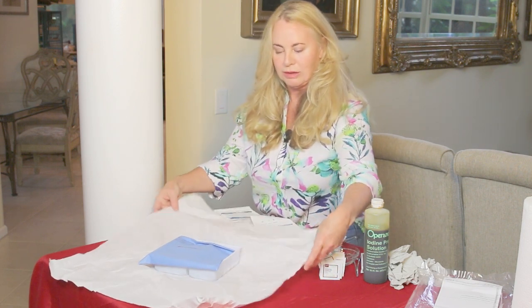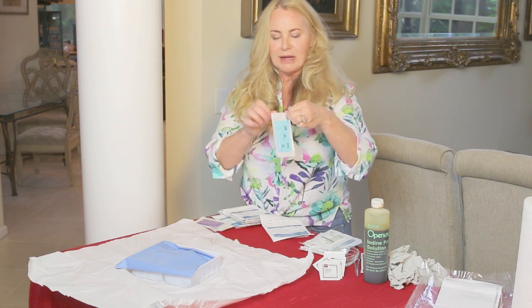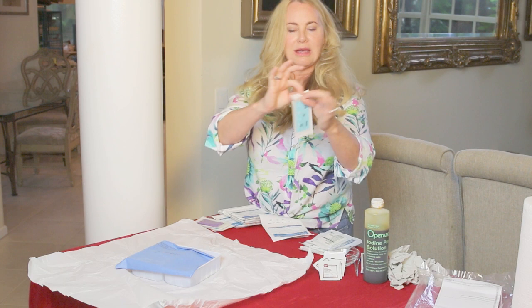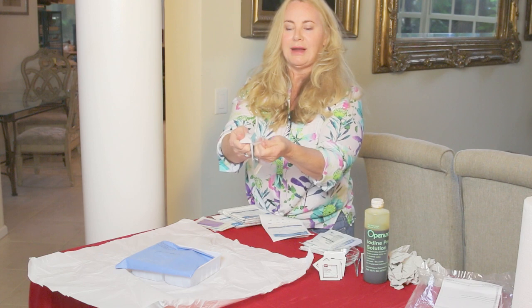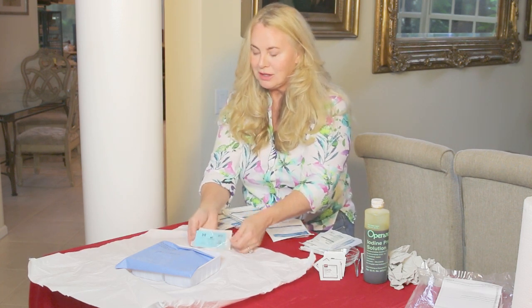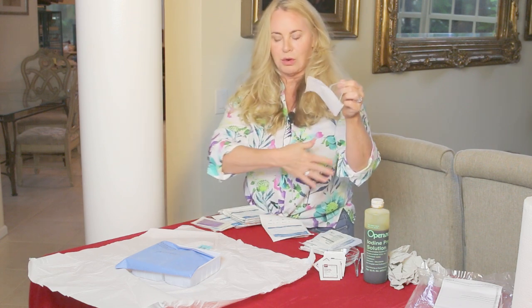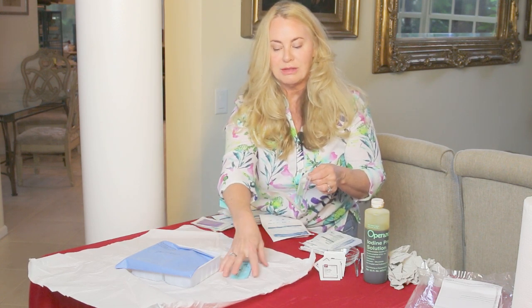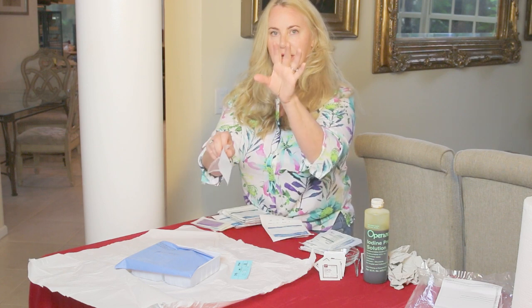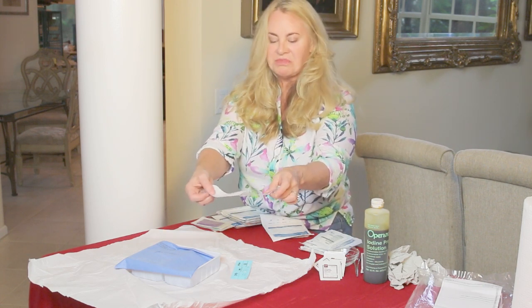Also, the packages show you where they're going to open. This one has a little opening on the top — you can see that it folds down, it has two pieces: the paper backing and the clear front. You want to take this, pull that apart, and do not touch the inside of the package. I'm not holding it way up and I'm not touching the inside of the sterile field. You want to drop this just inside the sterile field — not too high so it floats off somewhere else, and not too low where you end up touching it. Pull the package open, peel it back, and let it fall like a paratrooper to the ground — maybe eight inches or so. That would then be disposed of.